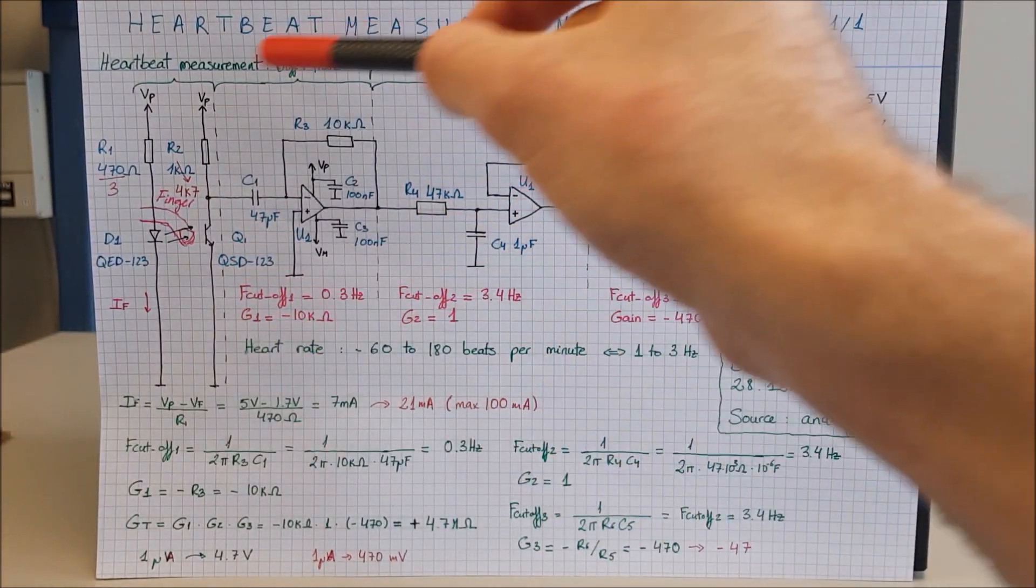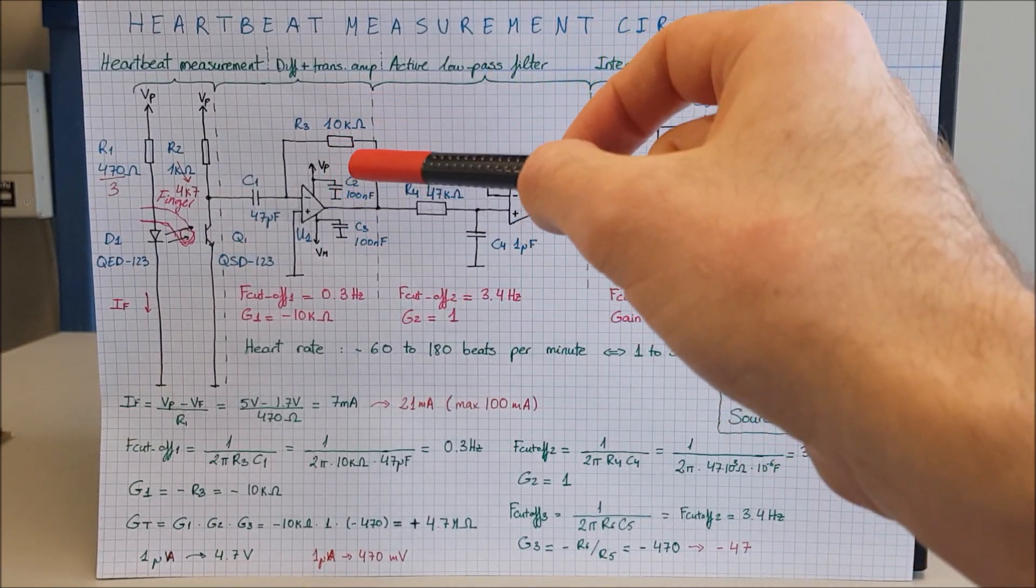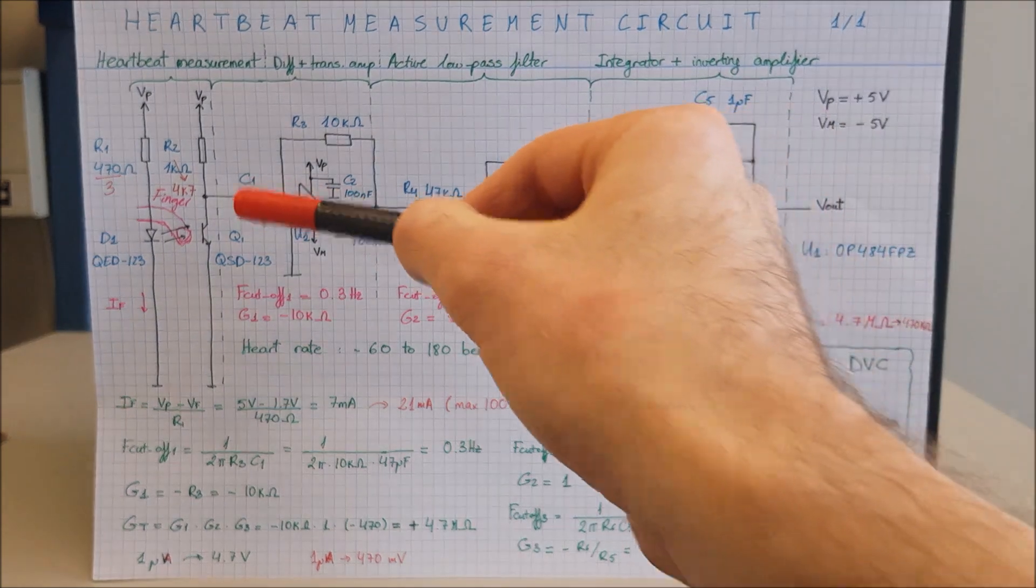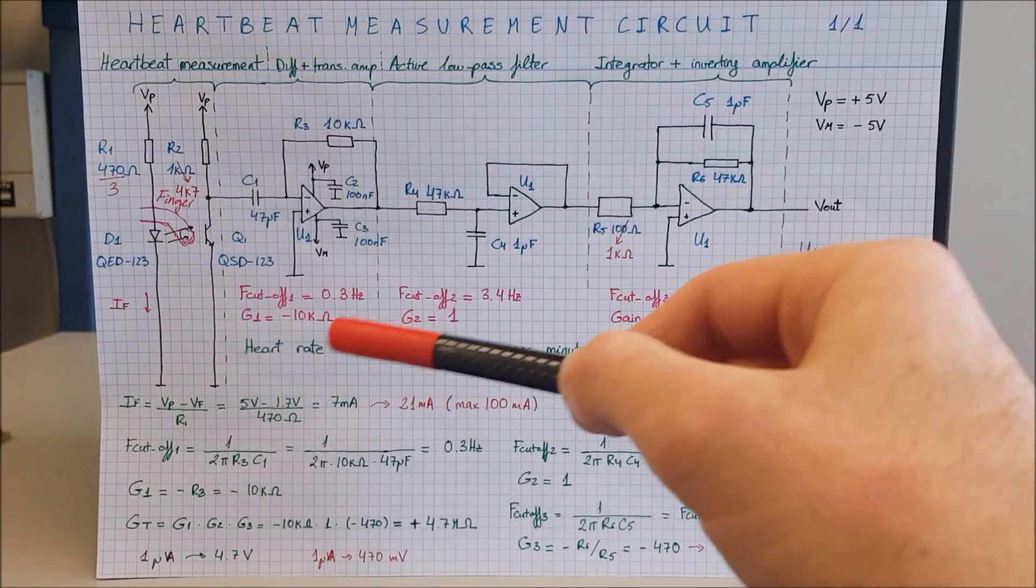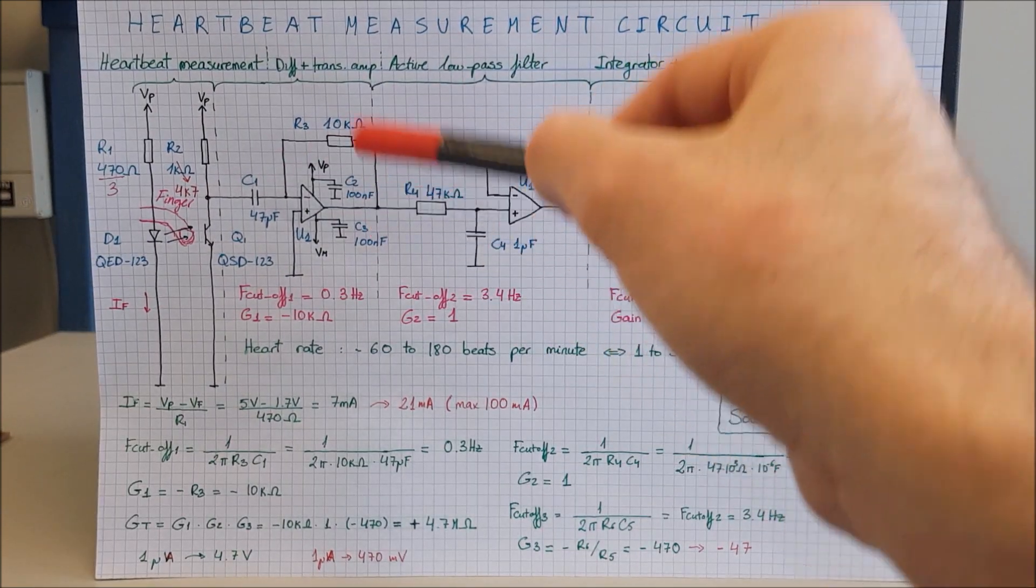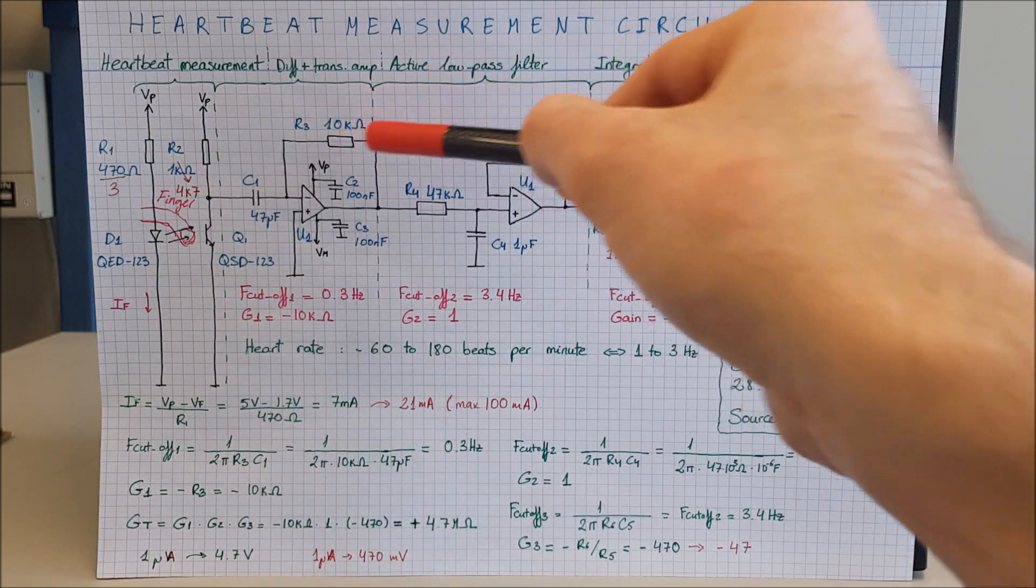We want to amplify the signal because this is tiny so we use an amplifier. This is known as a trans-impedance amplifier. It takes a current flowing through C1 and gives you a voltage output. From current to voltage, and the gain is minus R3, so minus 10 kilo ohms.